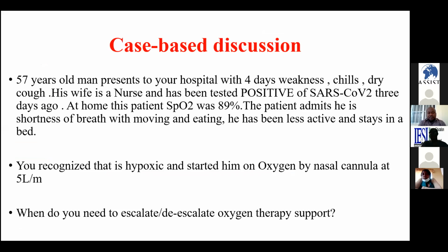So maybe no question. If no question, then, as we said, you detected that the patient has hypoxemia, and after having this hypoxemia, you have to know that the next thing to do is to give oxygen. How much, for how long? Let us have Dr. Joseph introduce us and talk about this. We hope that from knowing how to diagnose hypoxemia by using a pulse oximeter, we will now know how to treat it by using oxygen therapy without wasting the oxygen resources we have.